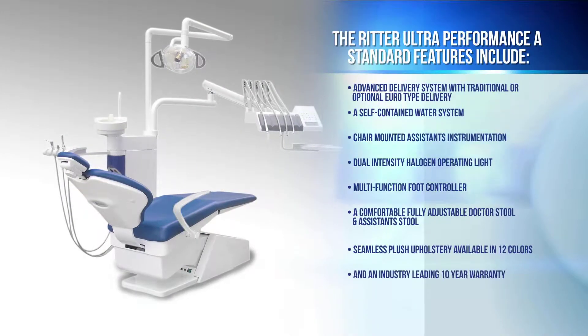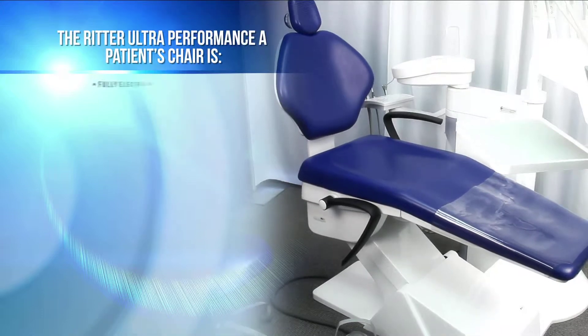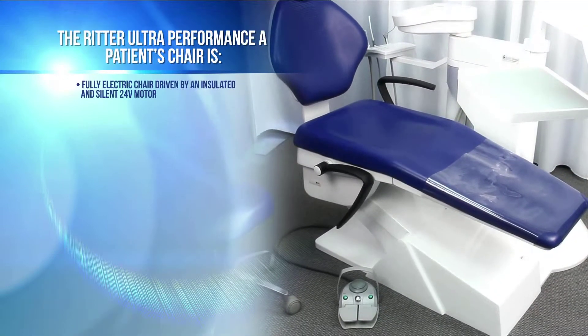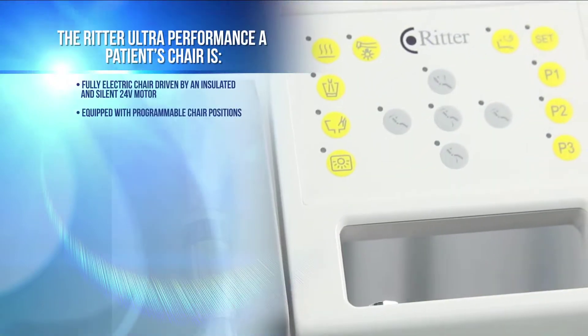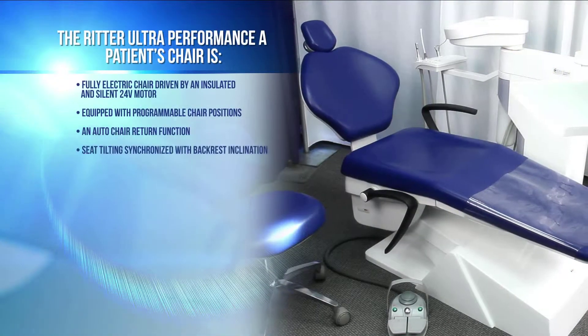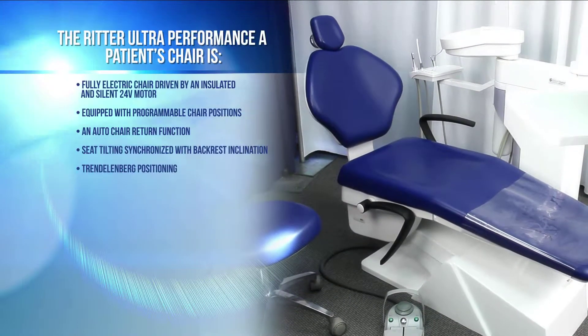The unit comes with an industry-leading 10-year warranty. The Ritter Ultra Performance A patient's chair is fully electric, driven by an insulated and silent 24-volt motor equipped with programmable chair positions, an auto chair return function, and seat tilting synchronized with backrest inclination, as well as Trendelenburg positioning.